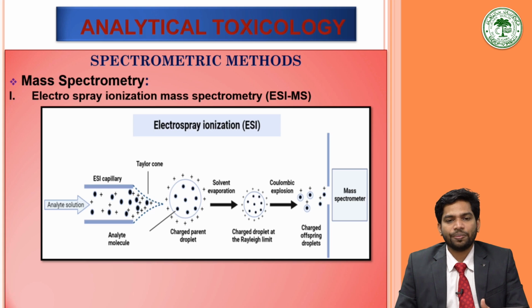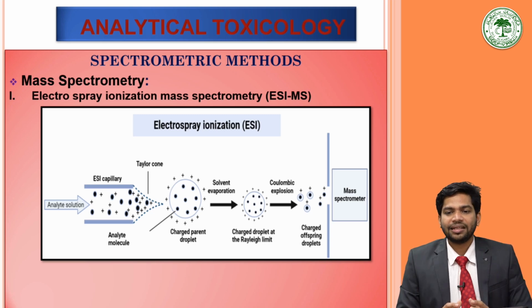The charged droplets generated at the exit of the electrospray tip pass down a pressure gradient and potential gradient toward the analyzer region of the mass spectrometer. Another stream of nitrogen drying gas and increased ESI source temperature further decreases the size of the charged droplet. This leads to an increase in the surface charge density and decrease in the droplet radius. So the movement will be faster.